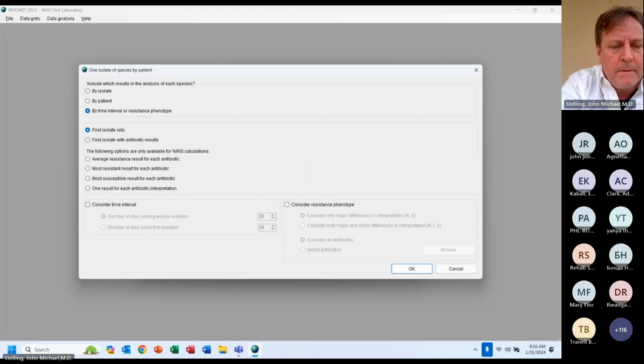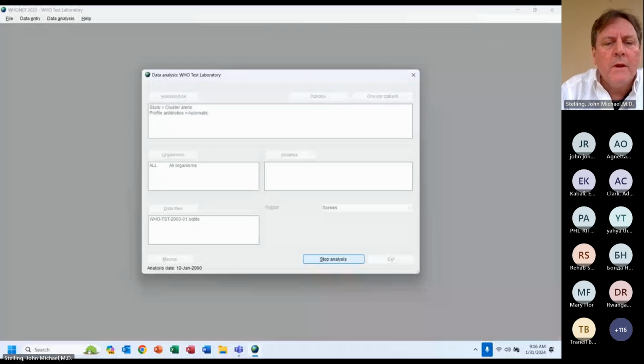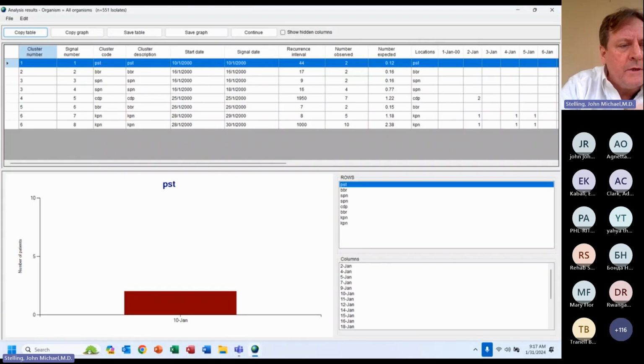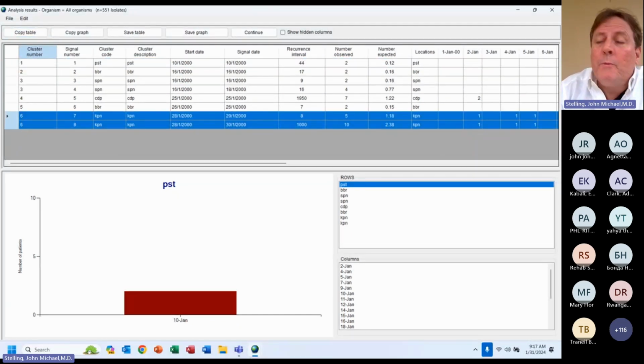Oops. Adam, we have a small invalid entry. I'm not sure what's in that. Okay. It's marching through the database again. And the diphtheroids. Okay, excellent. And okay, there it is. It's now numbered 6 and 7. We lost 2 signals because I now removed the repeat isolates.